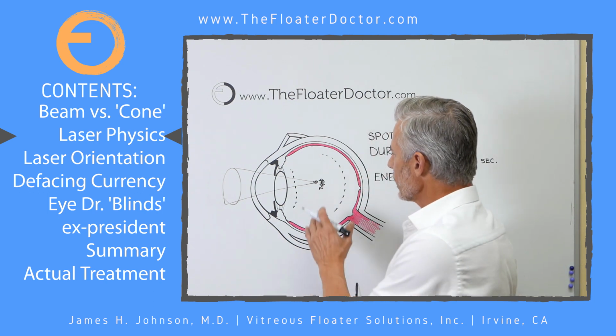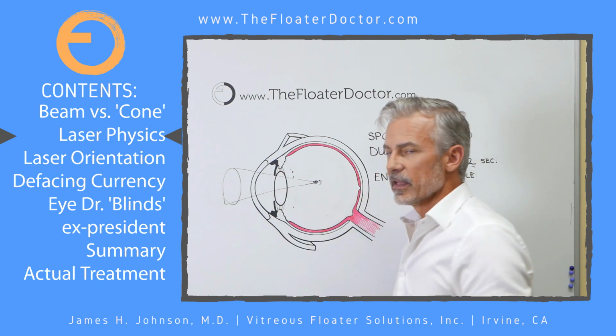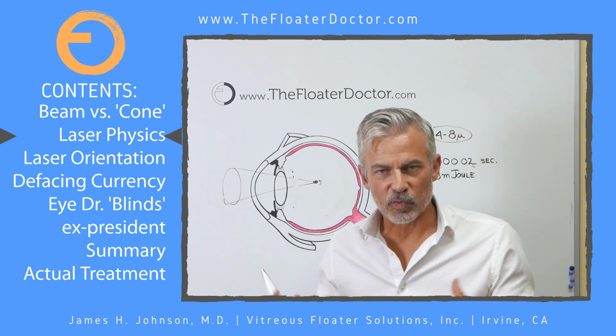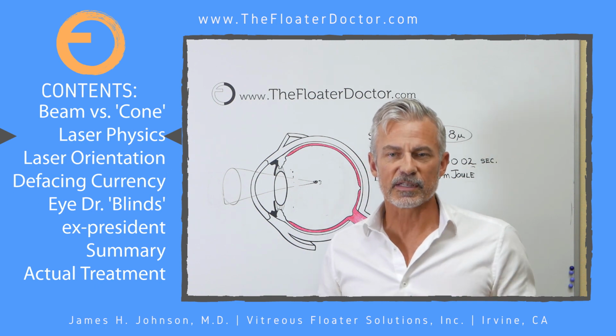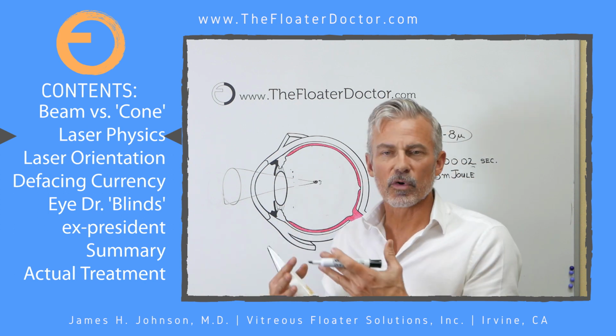So with treatment, there should be less of that material present when we're done than when we started. I have another video that talks about some of the setbacks where there can be some reformation of that, which usually just requires more treatment. But ultimately, we're destroying those proteins. And by the way, you don't have a factory that's making more of those proteins.